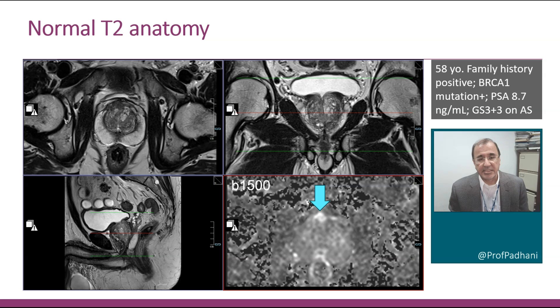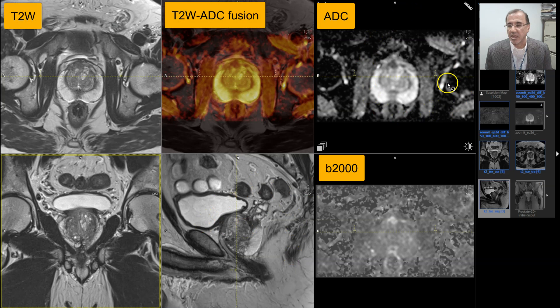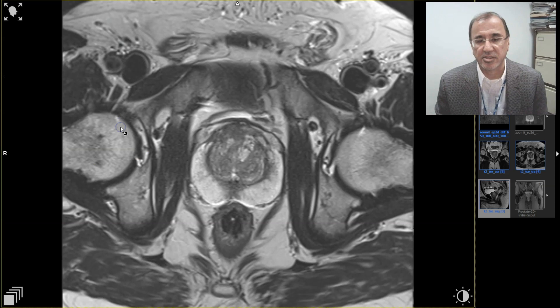Let's look at this man interactively. He's a 58-year-old man with a family history of prostate cancer who carries a BRCA1 mutation. He has a Gleason 3+3 cancer just behind the anterior fibromuscular stroma and is currently on active surveillance. On the top left we see axial, coronal, and sagittal images; the ADC map; a fusion image of ADC with T2; and the ultra-high B-value image.